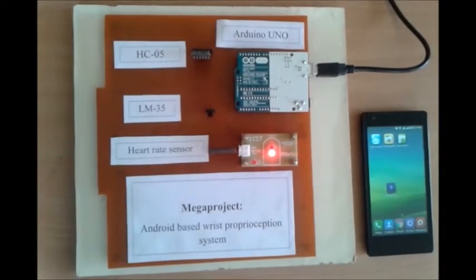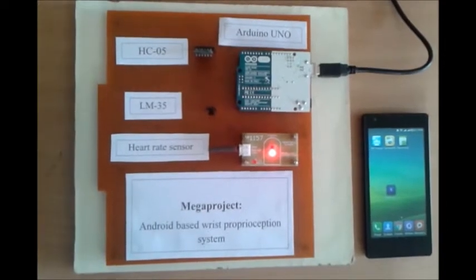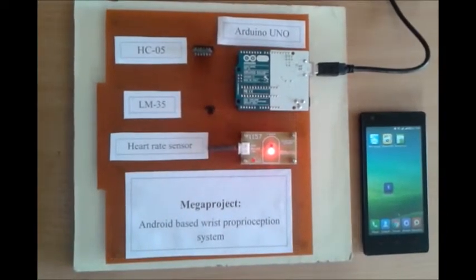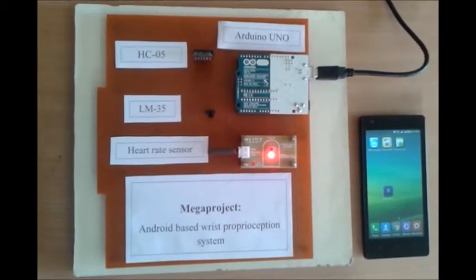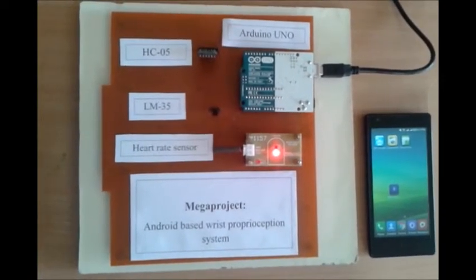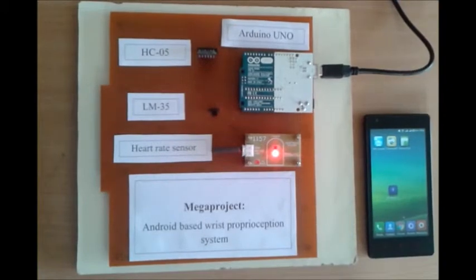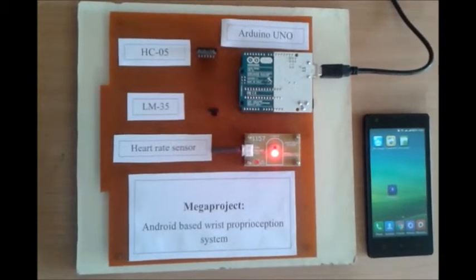Hello friends, this is our mega project. The name of our mega project is Android based wrist proprioception system. The purpose of this project is to investigate the development of software required for the wireless proprioception device. The motivation of this project is to allow patient monitoring at any instant, at any place for a person with known oxygen level problems. Let it be any rural area or urban area or homely use.